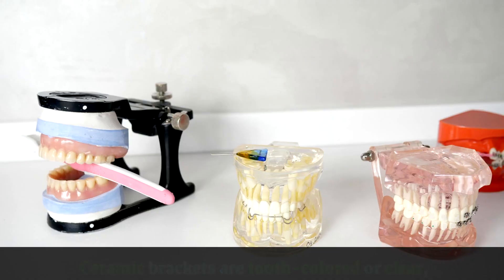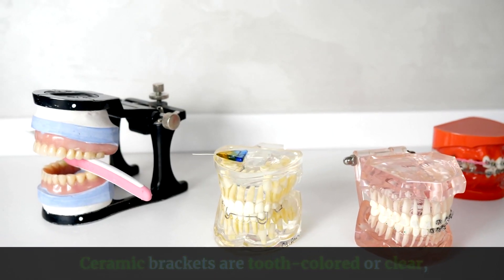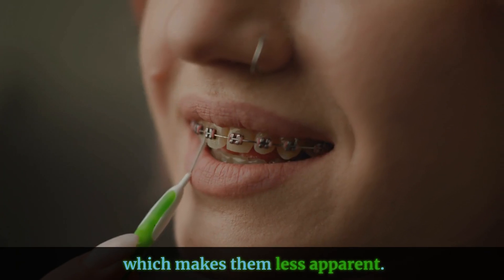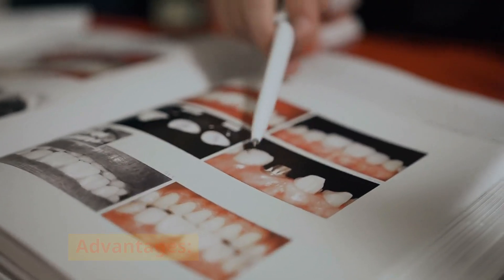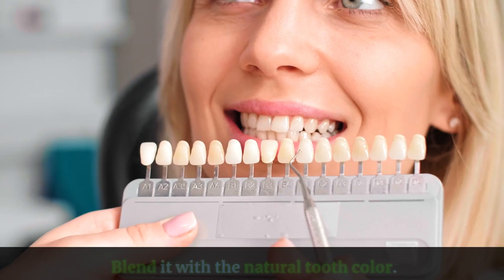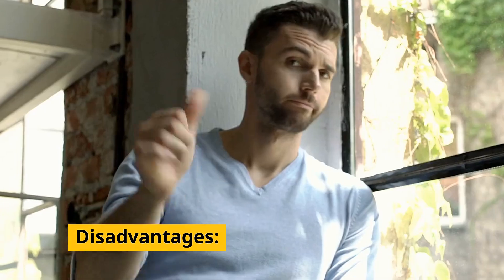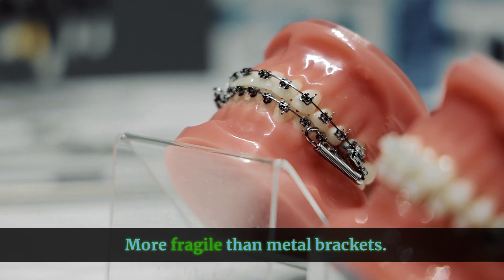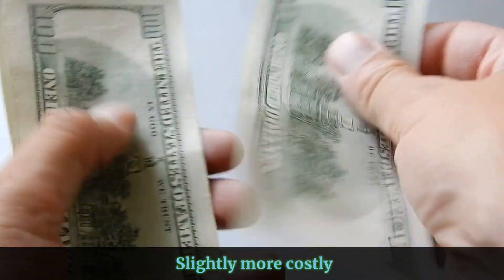Ceramic brackets are tooth-colored or clear, which makes them less apparent. Advantages: aesthetically attractive and blend in with the natural tooth color. Disadvantages: more fragile than metal brackets and slightly more costly.